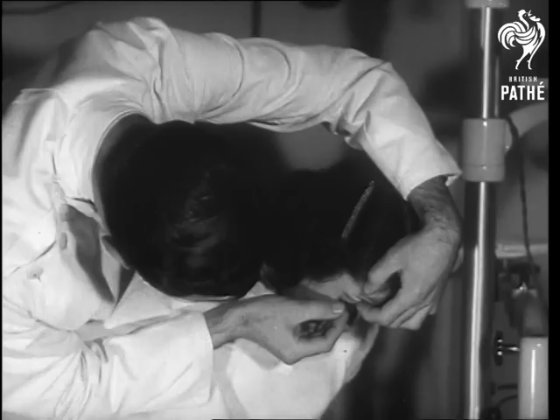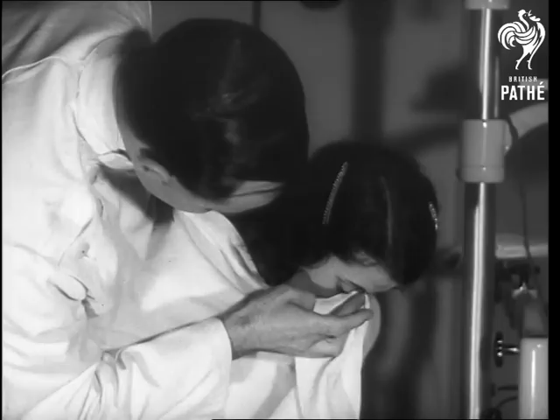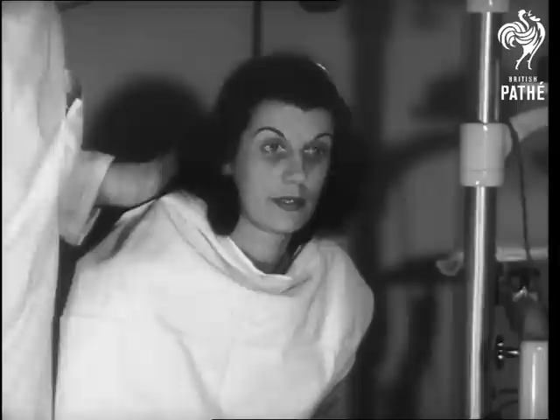Lenses are fitted and minor adjustments are made. Then a buffer solution is placed on the eyeballs and the lenses are inserted. Contact lenses can be worn for about six to eight hours without discomfort. Slight haziness after this time can be remedied by removing the lenses for a few minutes. Contact lenses — invisible and comfortable — a new look that's here to stay.